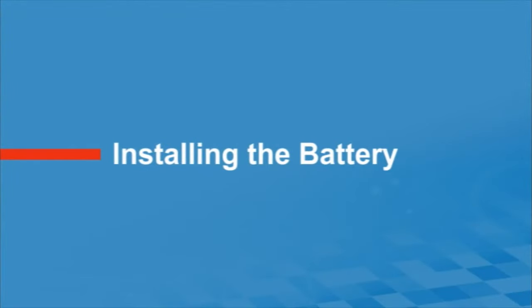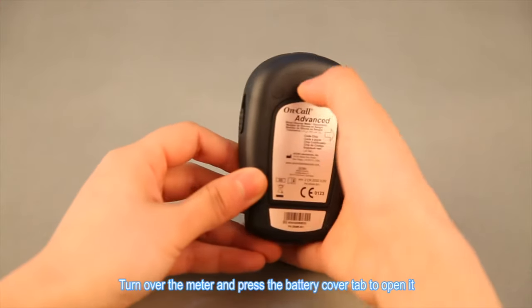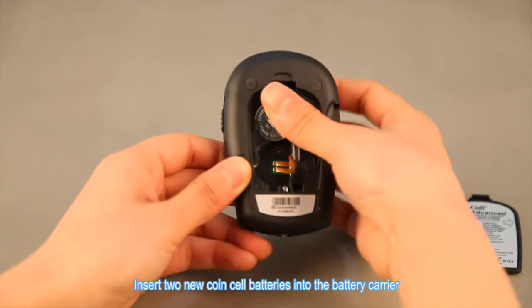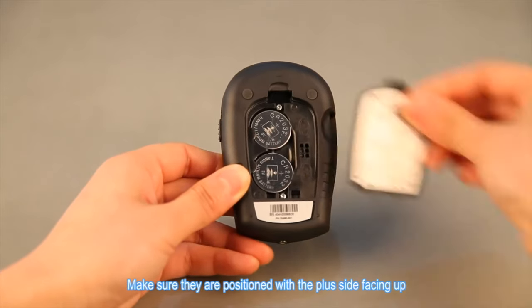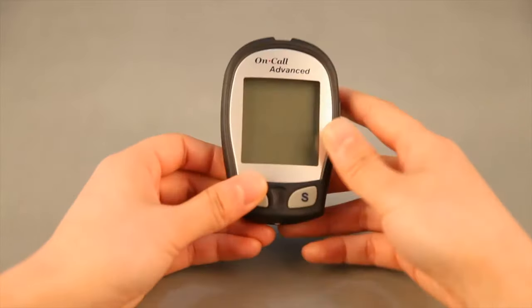It says 'PC' — I'm assuming that's 'please charge.' Where do I charge this thing? Do you have to buy a separate charger? The instructional video explains: turn over the meter and press the battery cover tab to open it. Insert two new coin cell batteries into the battery carrier, making sure they are positioned with the plus side facing up. Close the battery cover and make sure it snaps shut. Oh, it's battery operated — I'm stupid!